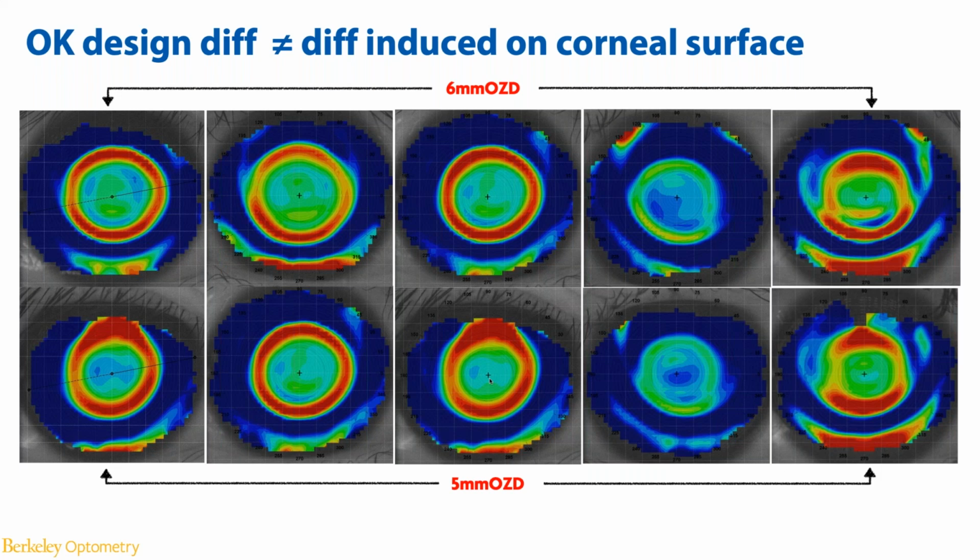So far I've had 4 patients that I have successfully troubleshot, who have pretty ideal centration and great ocular surface health, but just a tiny bit of undercorrection due to a slight undercorrection of the corneal center. By switching them into a 5mm lens without washout, they actually created a better flattening in the very center of the cornea.